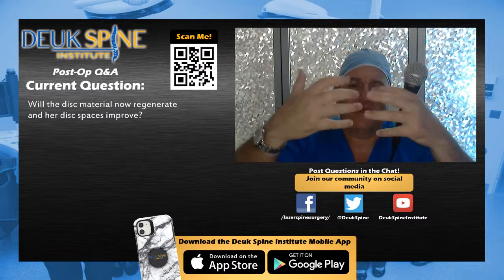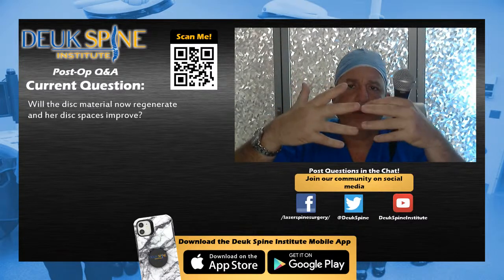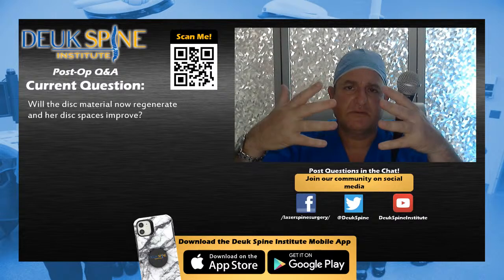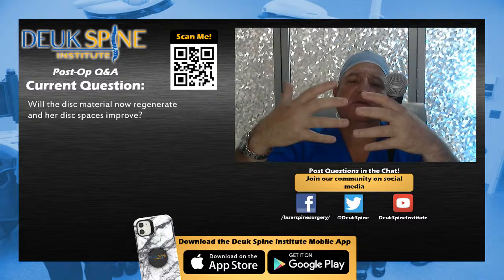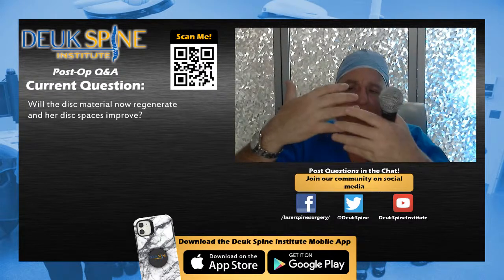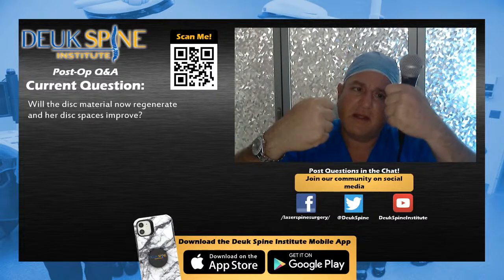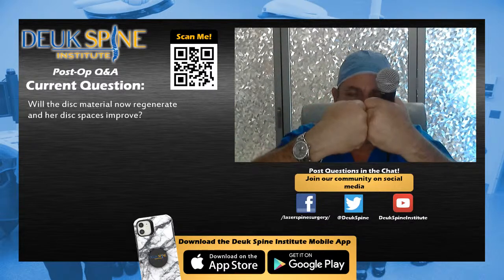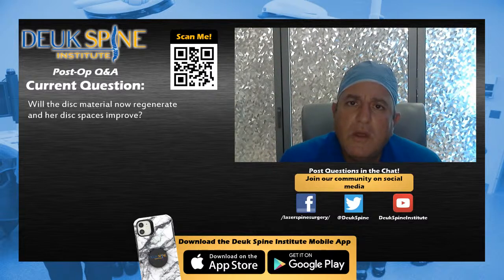Now it can heal because those ratty edges had nuclear material wedged in there called interposed nucleus pulposus, interposed herniation. And that was keeping the annular tear from resealing, okay? So I went in there and I cleaned all this up with a laser to get rid of it. And now you've got a clean edge that can close. And there's no more jelly wedged in there. That's why it can close. So I did a debridement of the annular tear.